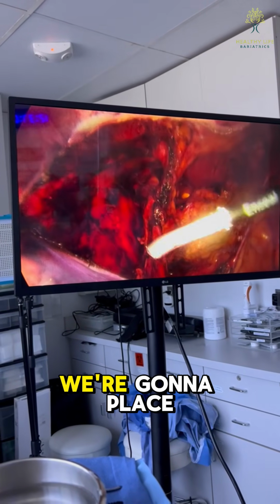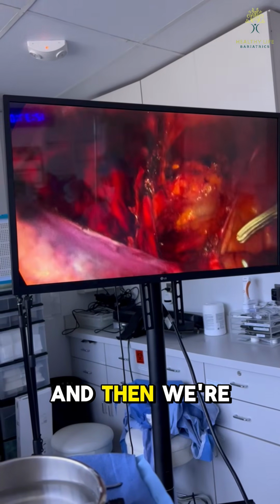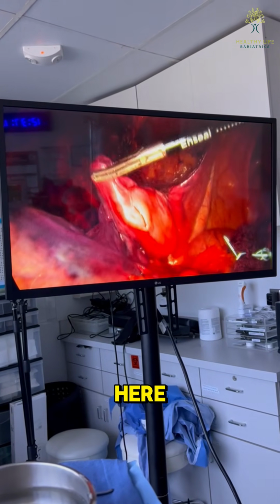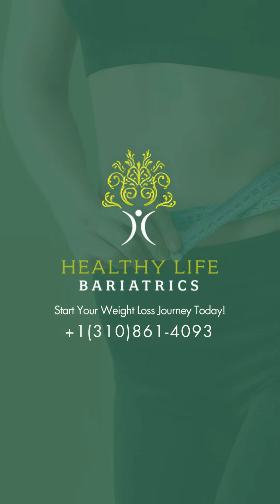And now we're going to place the mesh in this general area to cover this defect, and then we're going to use the peritoneal coverage, which is over here, and cover the defect that we have created.